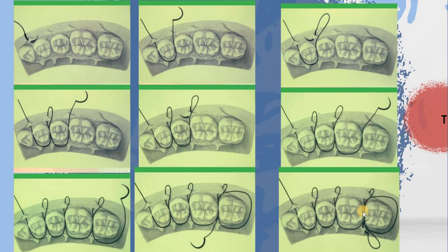You wrap it on the lingual side, insert on the lingual side, and wrap it on the buccal side. Insert it on the lingual and wrap it on the buccal. Then after that, you reach the first point as you started. And when you pull it, every tissue stays tight and remains in its exact position.